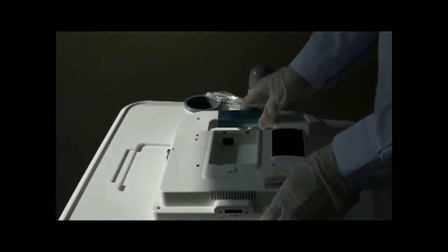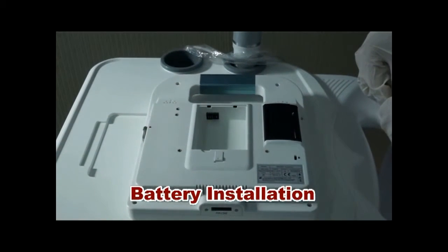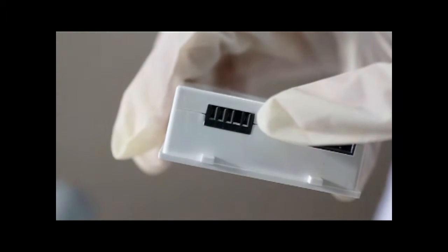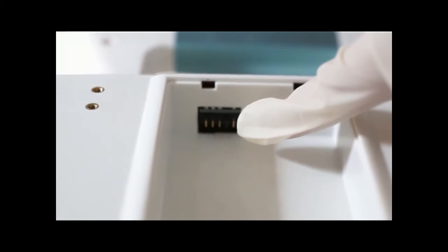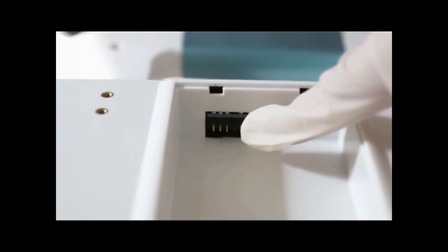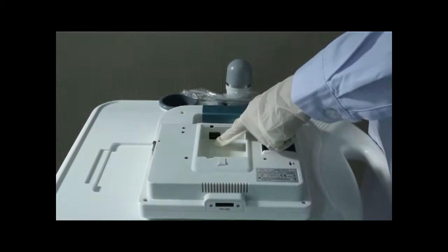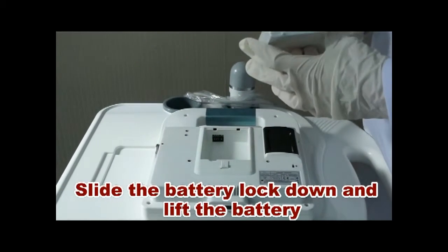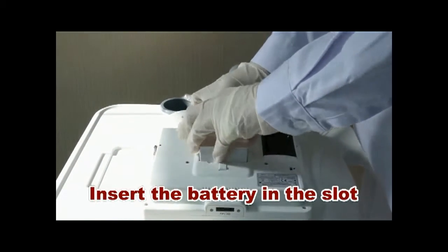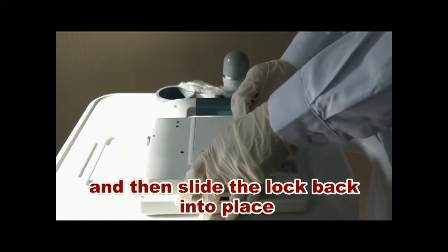Installation. Battery Installation. Slide the battery lock down and lift the battery. Insert the battery in the slot and then slide the lock back into place.